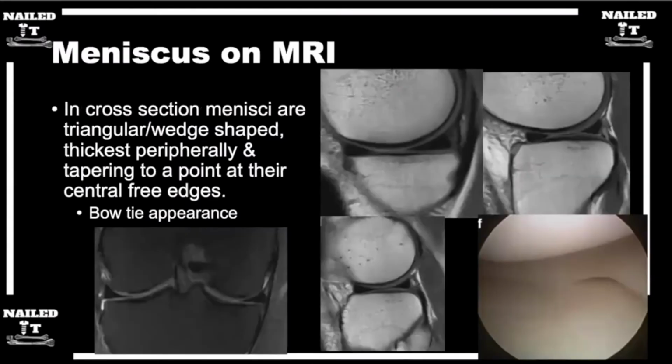So, all right, I guess we can move on and talk about different structures, what they look like normally, and then what they look like when there's injury. One of the big things that, at least as a med student, they used to ask me all the time is looking at menisci and seeing where the tear is. So can you go through what a normal meniscus should look like on an MRI?